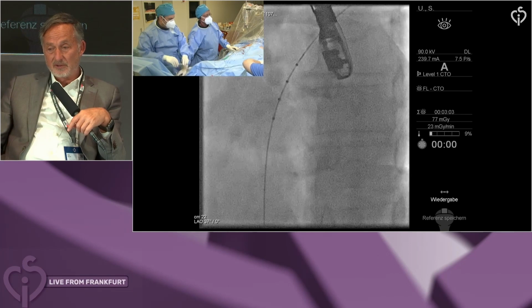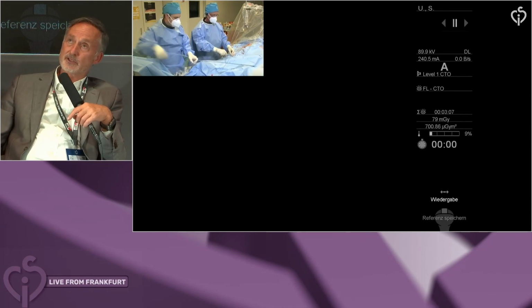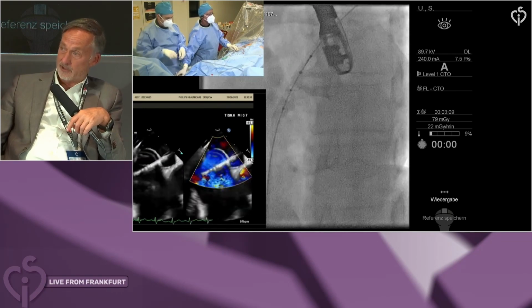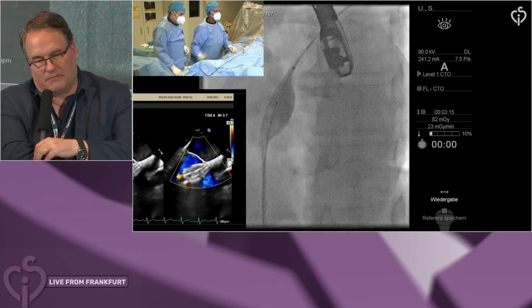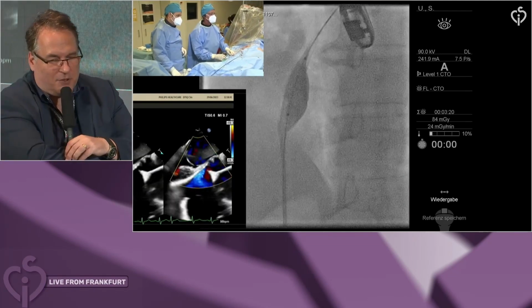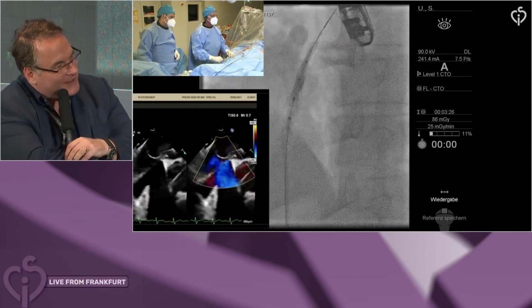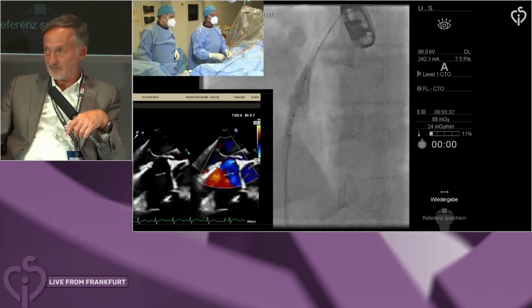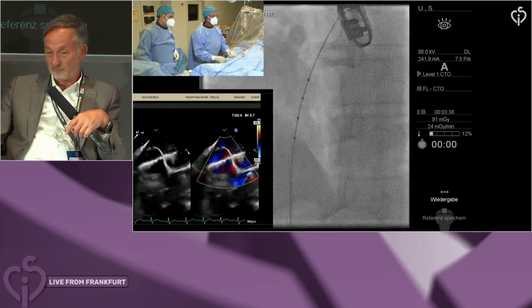Well, for me, the utility of using a balloon is not only sizing, but to take a look if you have a long tunnel, whether it's rigid or not. Because that's going to impact your ability of collapsing the device, depending on what device you use, versus having a splayed device because of a very long, rigid tunnel. But in pediatric cardiology, I've also seen size increases by balloons that are not necessarily necessary. So that's always the question, right? I mean, the physiology of that balloon-induced enlargement, to me that's always an open question. I don't know what it means, but.